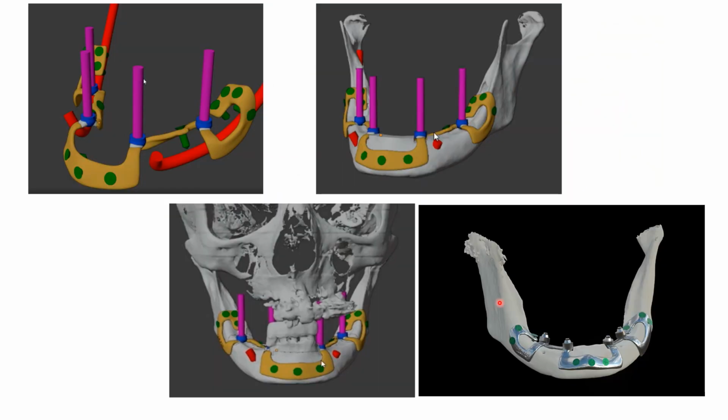Now, something a bit more on the subperiosteal implants. Because of the advent of the CAD/CAM and the intraoral scanners and the CBCT, now we do not need to do extensive surgeries to reflect the flap to take the impression. Using the CBCT, the implant is designed taking into consideration the inferior alveolar nerve, the lingual nerve, and the various anatomical considerations, and the implant is designed on exocad software, and then it is milled or laser sintered using titanium. So these are custom implants.